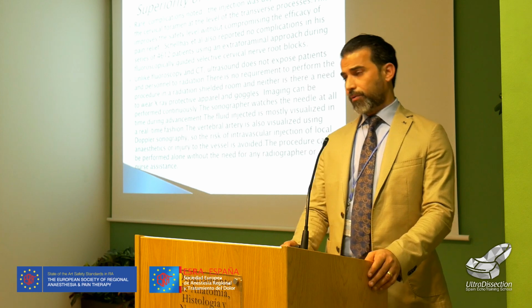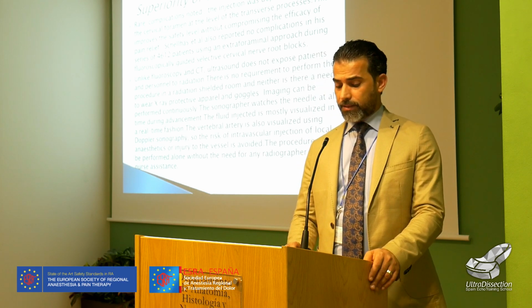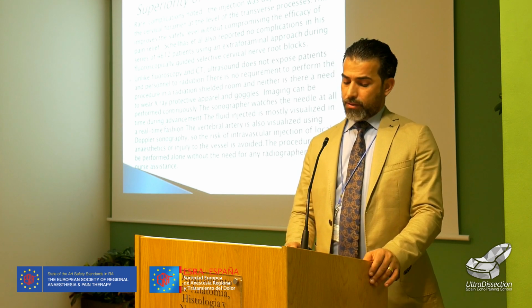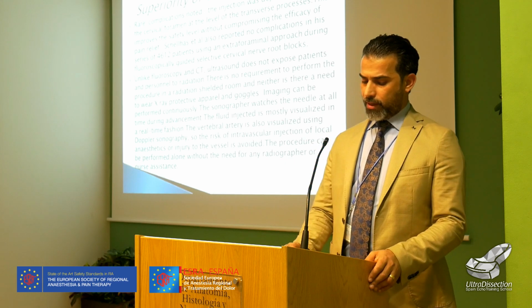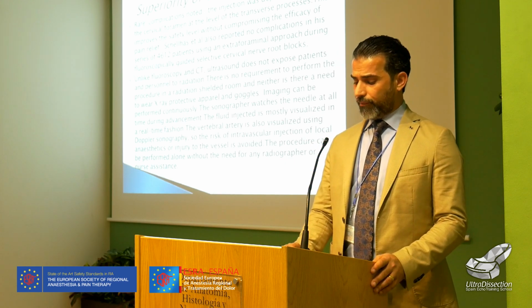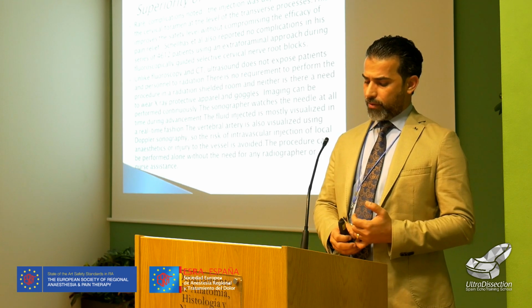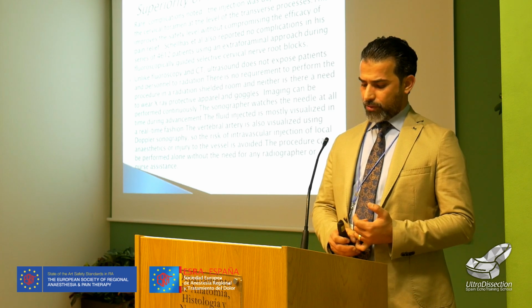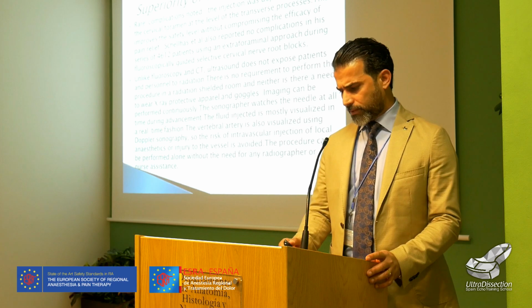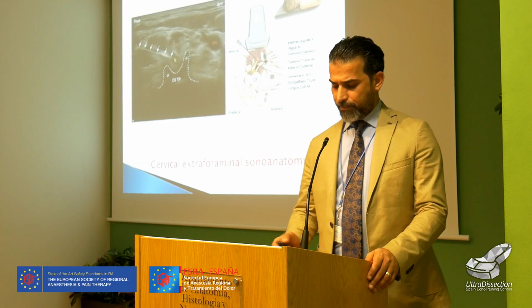Imaging can be performed continuously. The sonographer watches the needle at all times during advancement, and the injected fluid is visualized in real time. The vertebral artery is also visualized using Doppler sonography, so the risk of intravascular injection of the local anesthetic or injury to the vessels is avoided. The procedure can be performed safely by ultrasound in skilled hands after training, so it will be very easy.